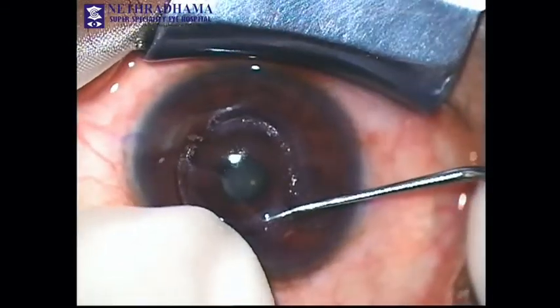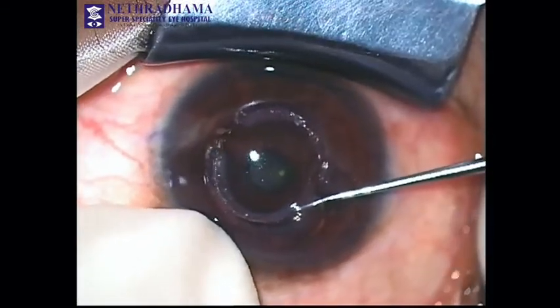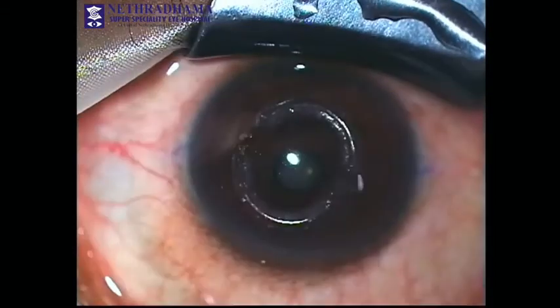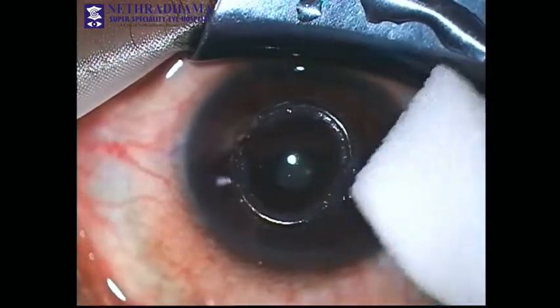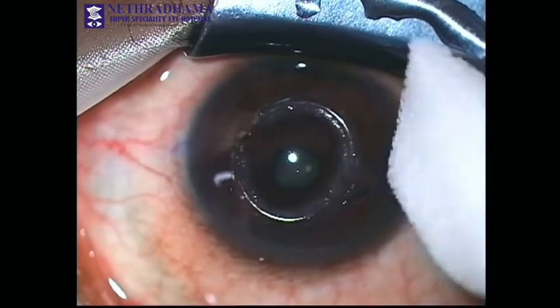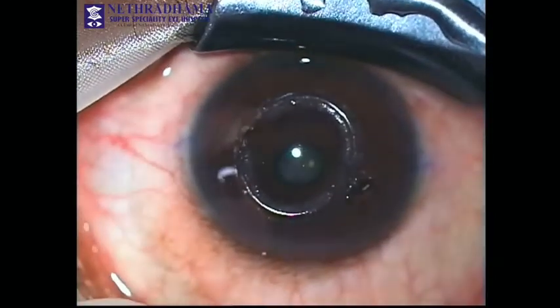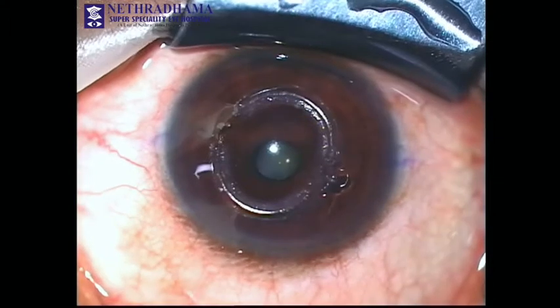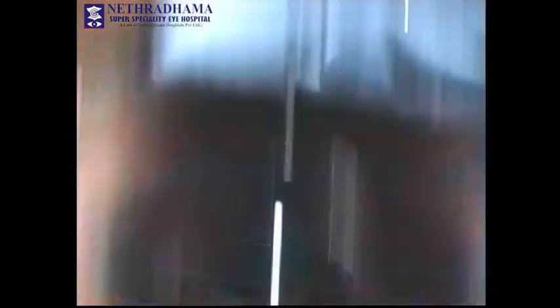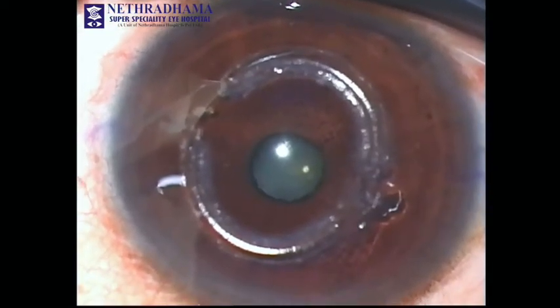The ring is moved so that it is away from the incision and symmetrically placed. Since the incision is very clean, there is no need to suture. Some surgeons suture the incision, but if it is not distorted then there is no need to suture. You can see that the light reflex has also improved and it is clear. That is the high magnification — you can see that the rings are very symmetrically placed and well centered.